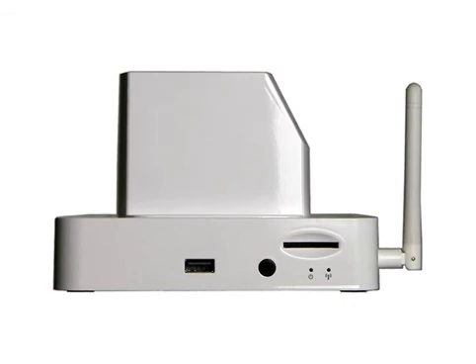On the front of the dock station are the camera cable connection, the SD card slot, the power LED, and the connection LED.